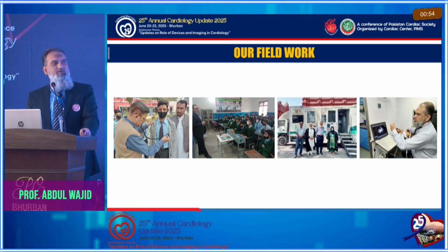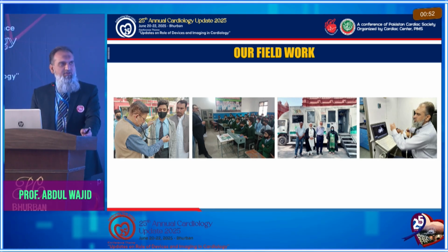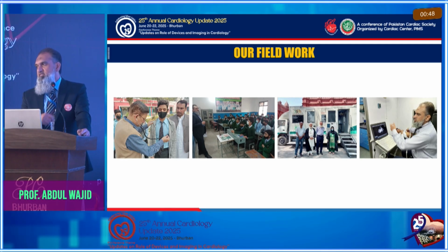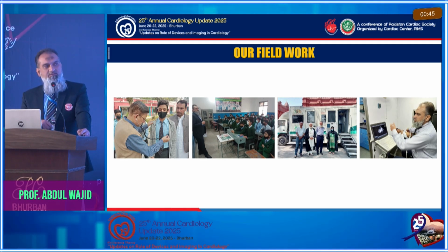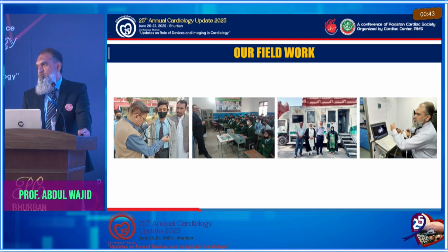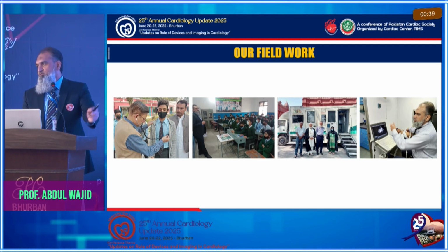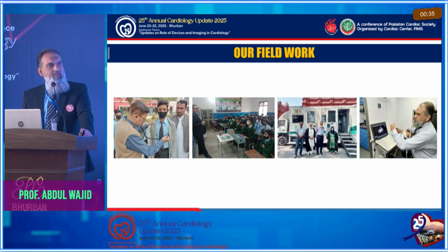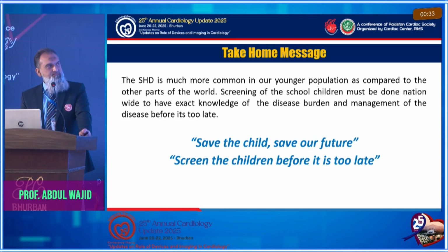This is our mobile van, which has air conditioning, and an echocardiography machine can be placed inside it. There is a table, chair, everything inside. You can screen the children even in a village where there is no facility. We can use this mobile van without any other thing. And this is the echo machine.